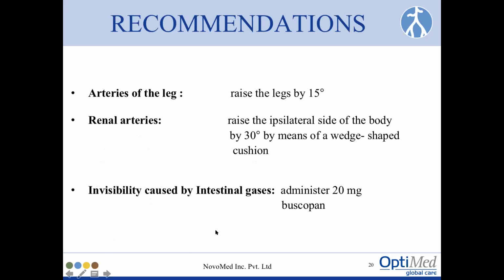There are certain technical things that you need to know when you do a carbon dioxide angio. If you need to study the arteries of the legs, you need to raise the legs by about 15 degrees, slightly up, so that you get a better travel of the gas into the leg.